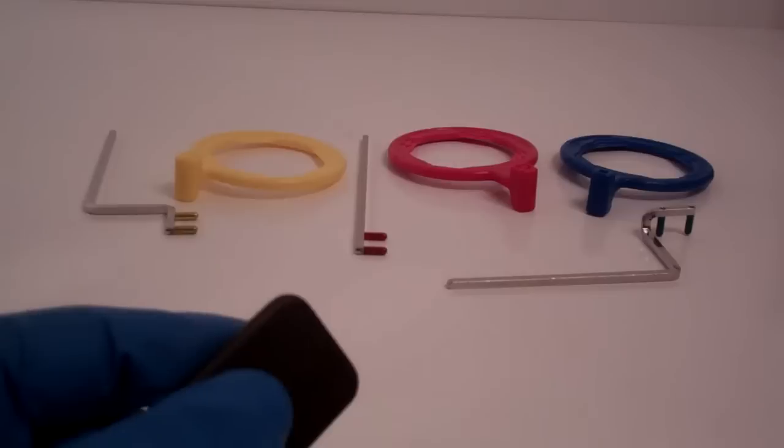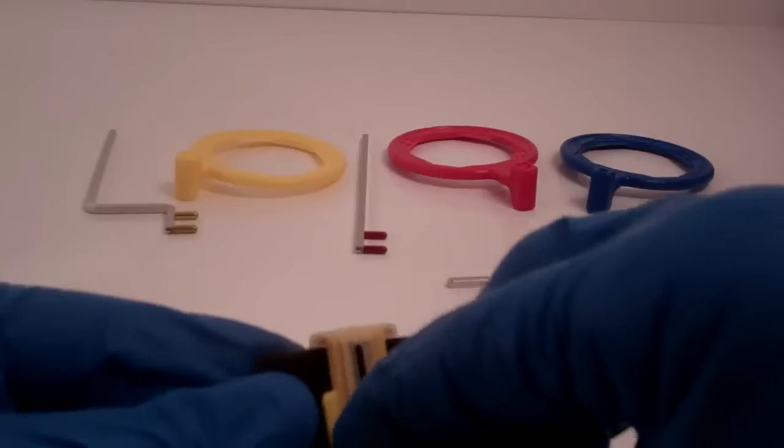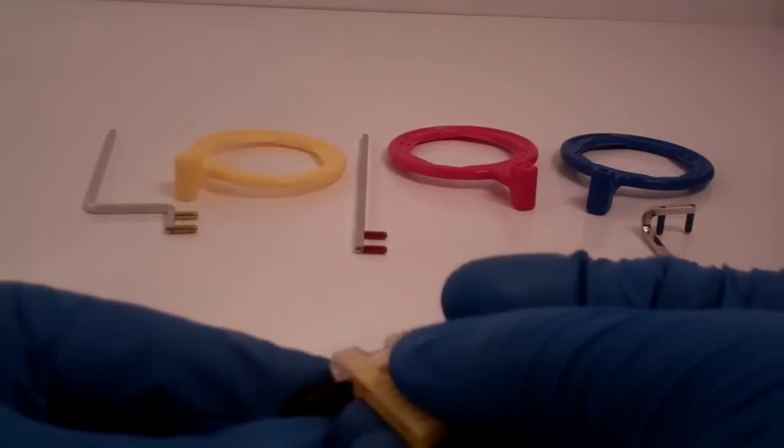And there's a bite block for each indication. The yellow would be the posterior, and you can see how that attaches there. And quadrant changes are quite easy with this sensor holder. You can see how quickly I just flipped that over.